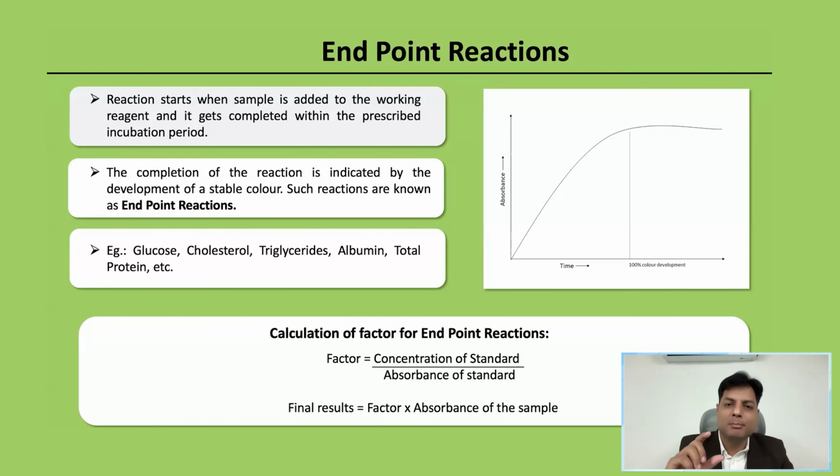Now, what is the point where we have to take the absorbance? Do we wait for the reaction to complete and then take the absorbance? Or do we take the absorbance while the reaction is still in progress? In case of an endpoint reaction, we wait for the reaction to first get completed, then take the absorbance. Why is this so?